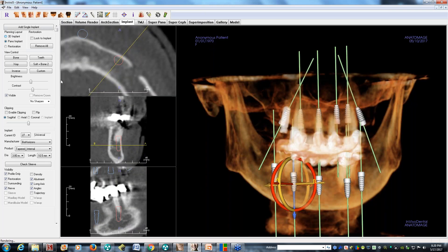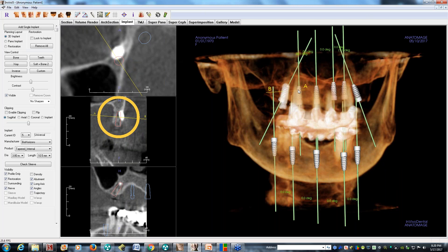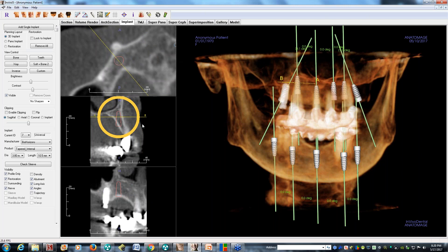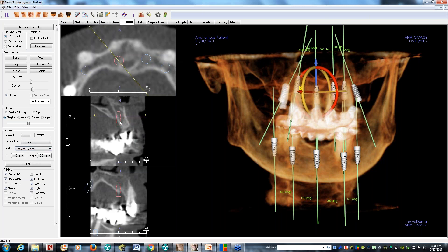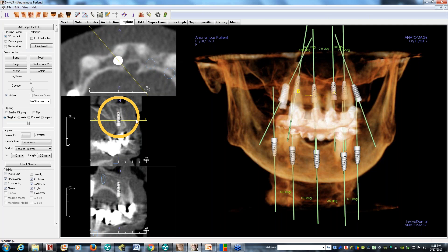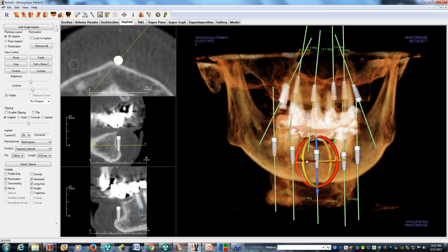Here we go — implant fit at 3.8mm; we've been using BioHorizons implants for a long time. We show the patient the implants placed in the CT planning software — it's always impressive to them. We do the same visualization for the upper and lower arches so the patient can see the plan clearly.